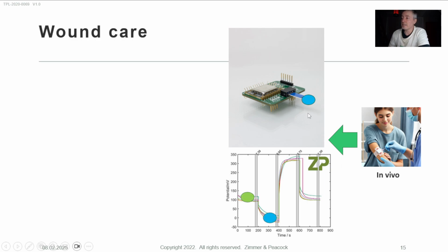You can put on an alkali solution. You can put on an acidic solution. And actually you can demonstrate as a proof of principle, but also it can be a paper, that I can take a wound-like solution and change its pH, and I can measure its pH accordingly, and therefore this will be a platform for doing smart wound care products.